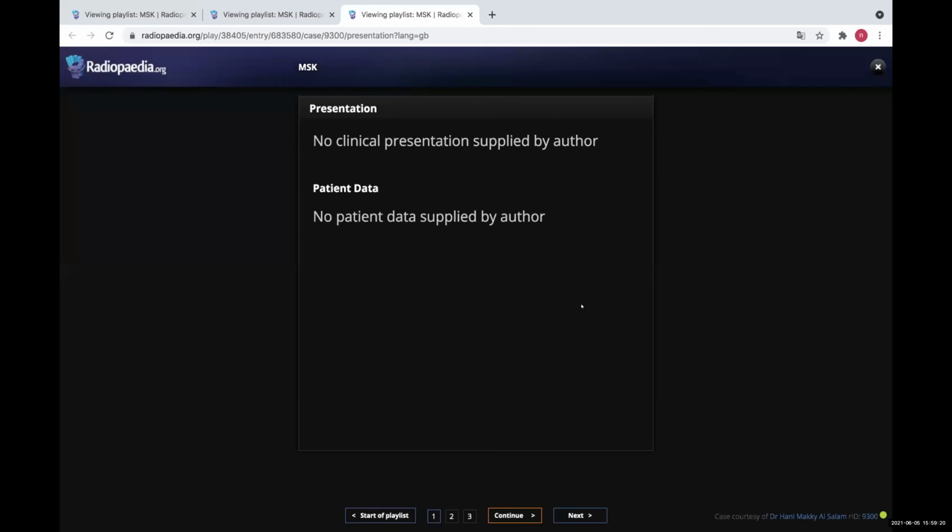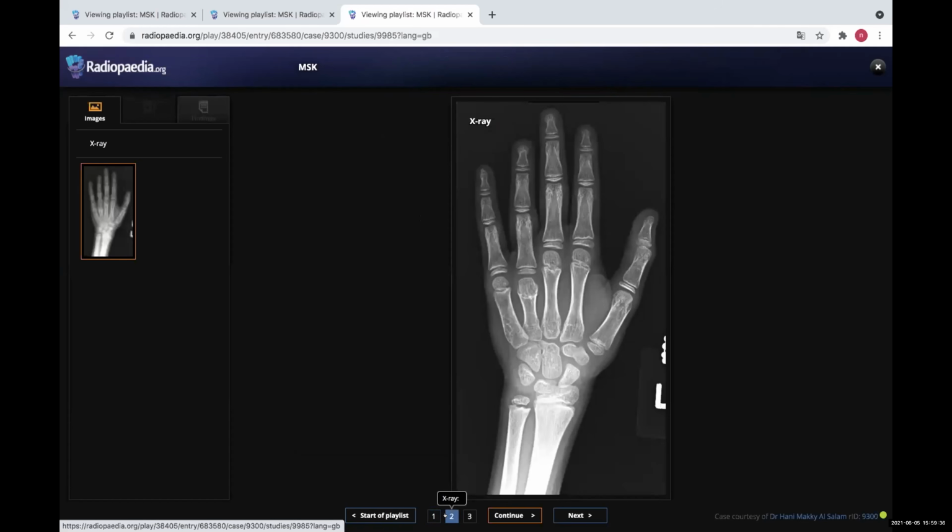Screen over to you, Dr. Nuran. Okay, thank you. Hello, good afternoon everybody, and I'm the first examiner. Is Dr. Vijaya here? Yes, I'm here. Okay, I will start with a very clear and straightforward case. What is this?